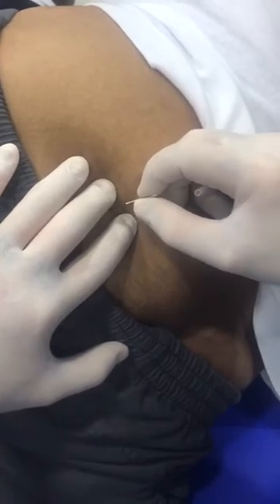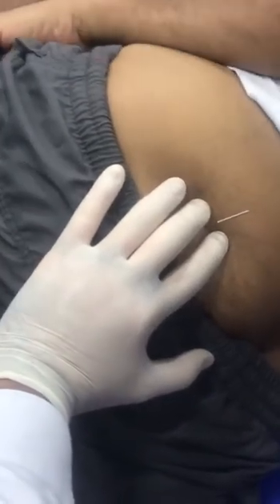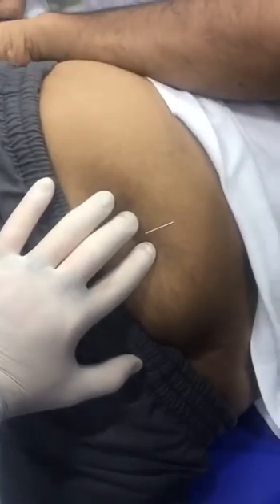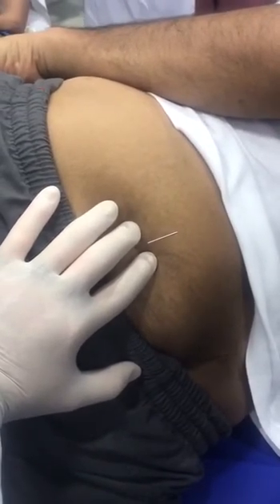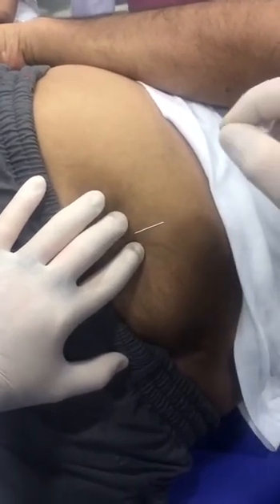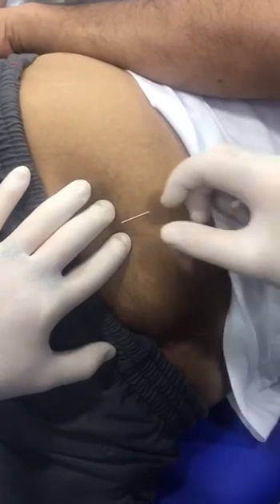So in that case, when I inserted for the first insertion, there was no obvious electrical feeling. That means the pain was radiating, not the sciatic nerve. If I start to move even without changing direction, this is a referral, not the sciatic. I may assume that, but if he's a physio and he's telling me it's electrical, I have to believe it. But if he was a patient, I would say, if I'm feeling twitches while moving and doing it very slowly, and I haven't felt any electricity, I shouldn't think this is the nerve. But as he is telling me, I'm going to trust.